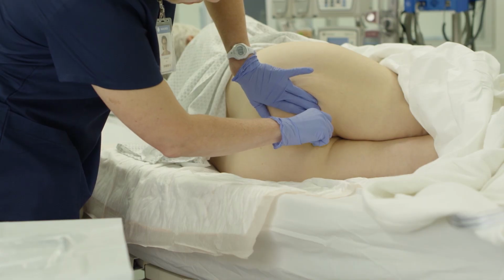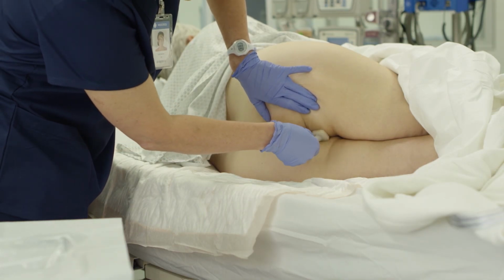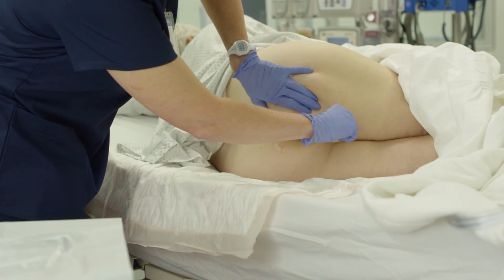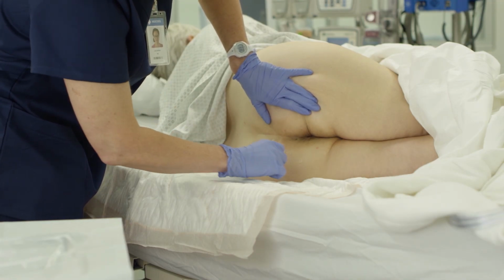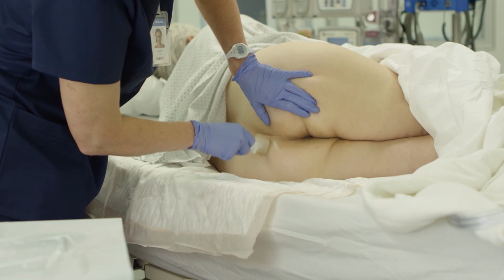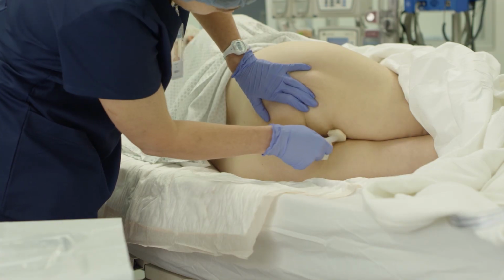Gently wipe the foam sponge across the affected area. Use a light, even sweeping motion with minimal overlap of the product as you move across the skin. This helps promote the drying of the product on the skin. Avoid wiping wet fluid over areas that have not yet completely dried.